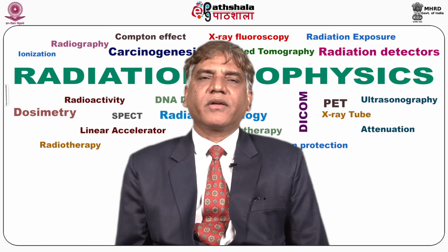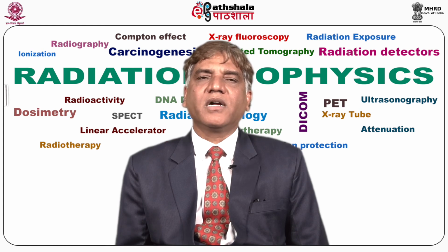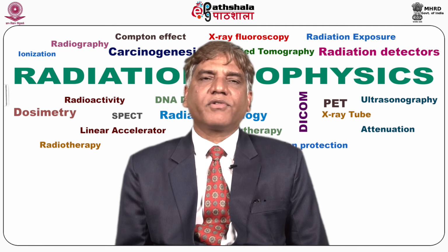But again here there was a disadvantage of the second generation CT scanner: increased scatter radiation as compared to the first generation CT scanner, and complicated mechanical motion of translate-rotate. Again sodium iodide detectors were used, for which the afterglow problem was there, and complex mechanical rotation.